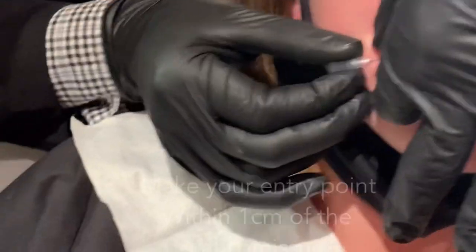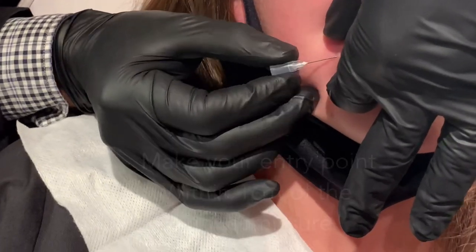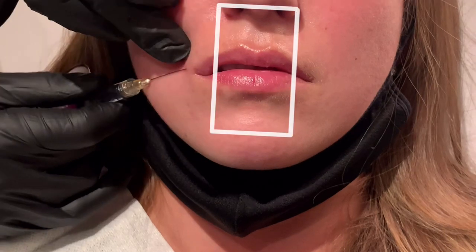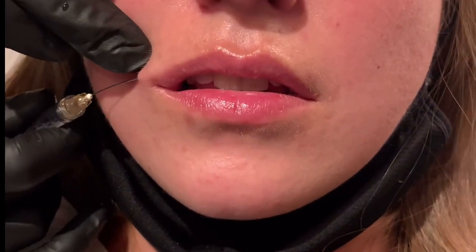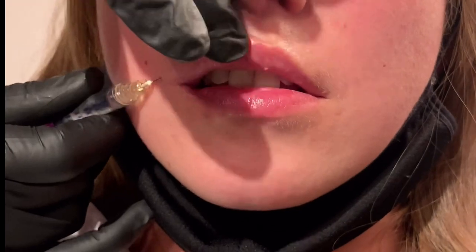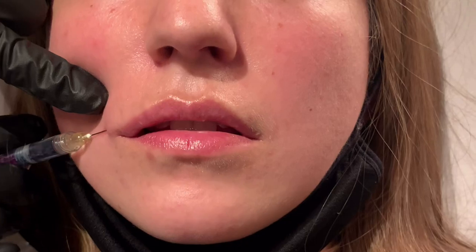Let's get started. I'm going to make my entry point within one centimeter of the oral commissure because I don't want to hit the facial artery. I'm going to take my cannula — it's 25 gauge — and to respect the golden ratio I'm going to place my product within the width of the nose. I usually do a retrograde fashion here, so I bring my cannula to basically the cupid's bow, then I place 0.2cc per quadrant.